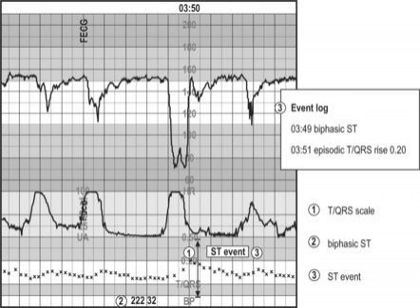The women were equally divided between the two groups. Women in the ST group were much less likely, 4.4% versus 9.6%, to undergo operative delivery of any type for fetal distress. And contrary to what we saw with the pulse ox, there was no difference in operative delivery for failure to progress. And not surprisingly, when they looked at neonatal outcomes, there was again no difference in any of the measured outcomes.